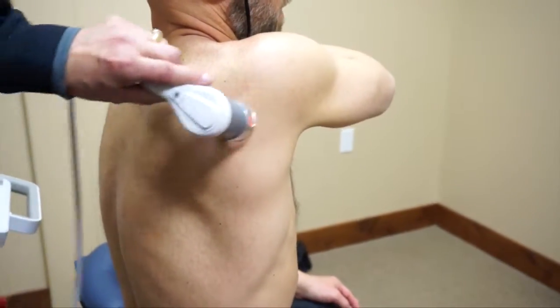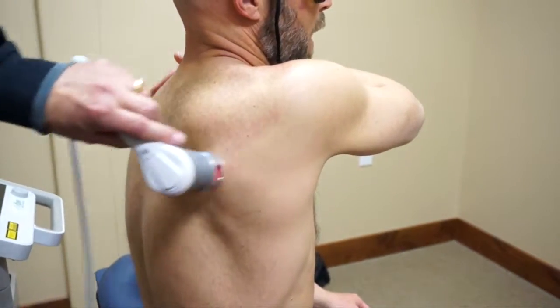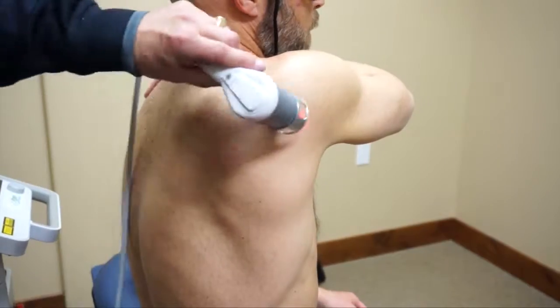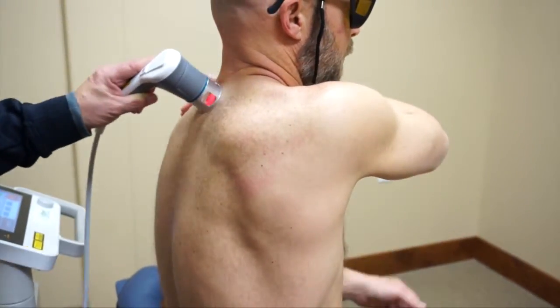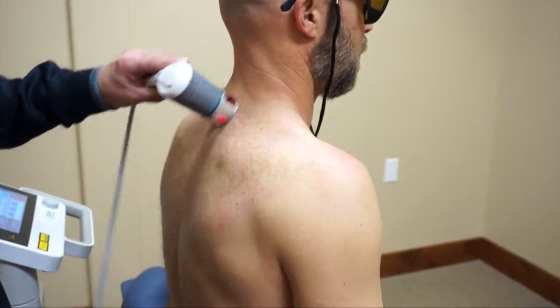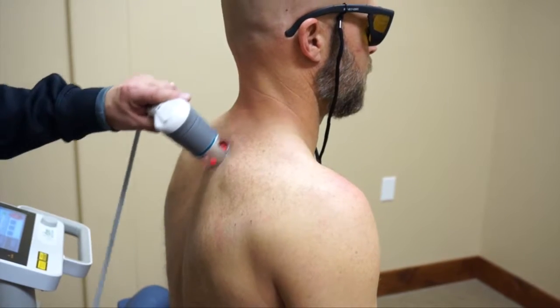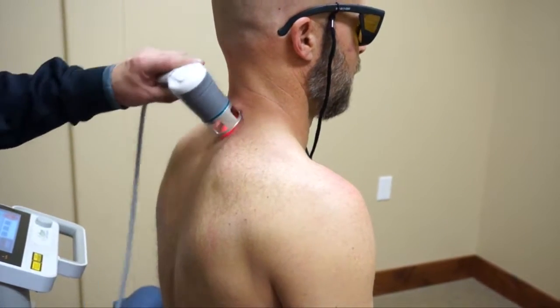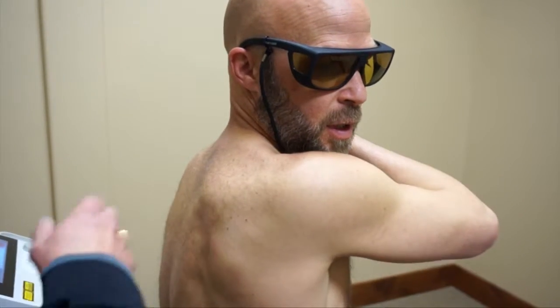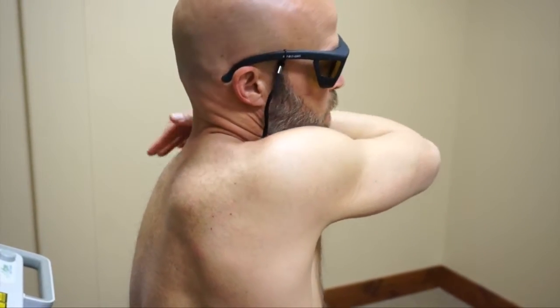Do you feel that tightening up in here again? Right there I do. But that's still a farther range than before — now at least I feel it there. Before I couldn't get there without assistance from my other arm. If you keep treating both spots, this is going to feel better even without touching it. All I did was treat back here and he's getting better range of motion. Definitely better range of motion.